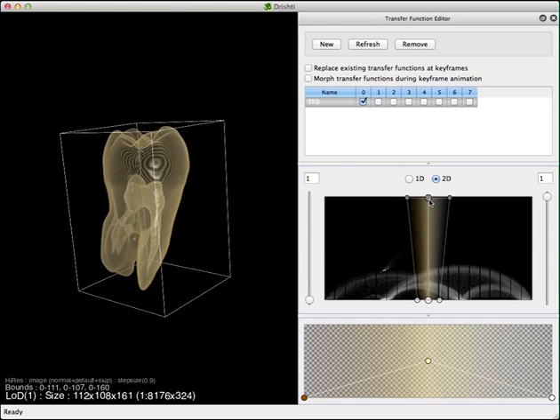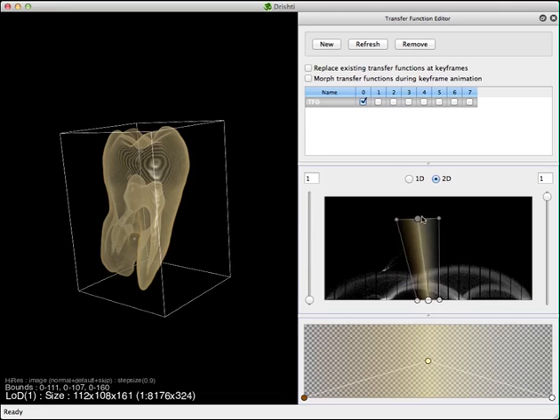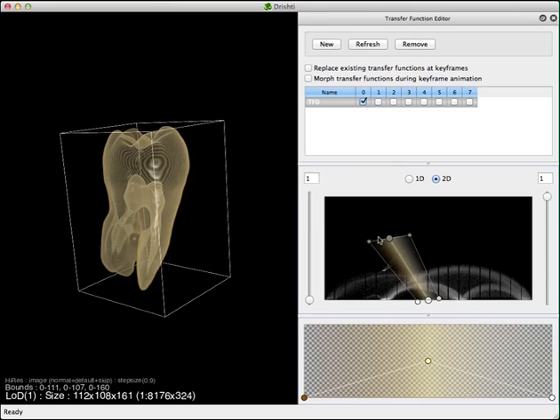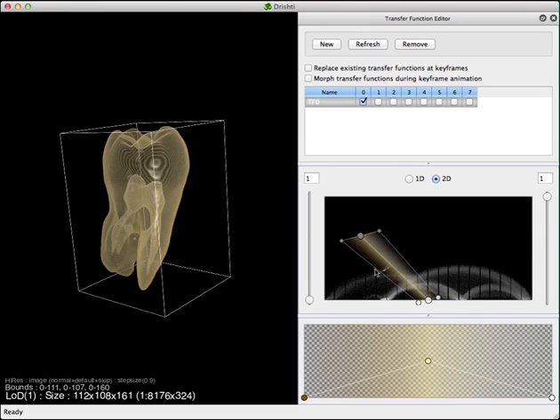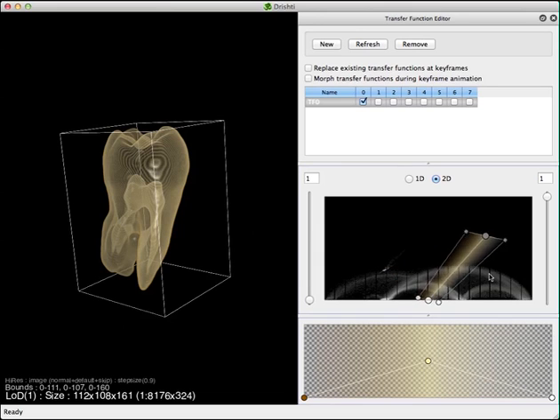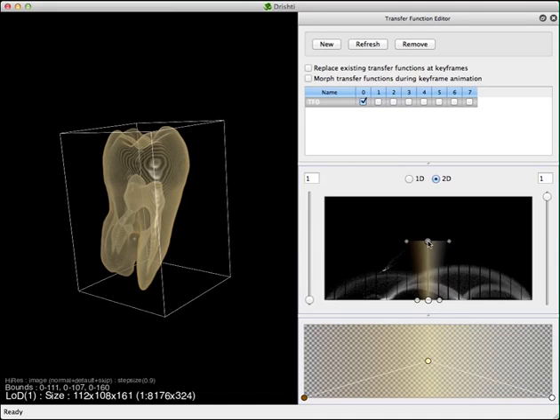Using the Shift key and left mouse button, we can move the end markers together. Similarly, we can move the middle point horizontally. Using the Alt key, we can restrict movement to the horizontal direction. If I remove the Alt key, we can move the point freely. Pressing Alt restricts to horizontal, and Shift key restricts to vertical direction.